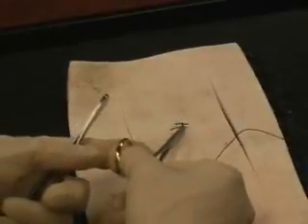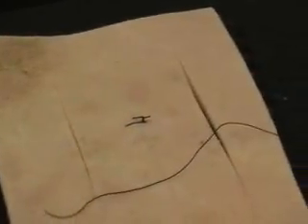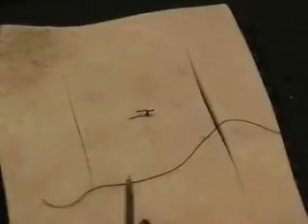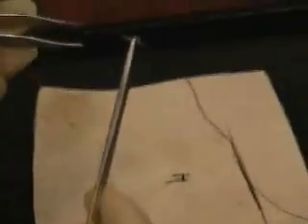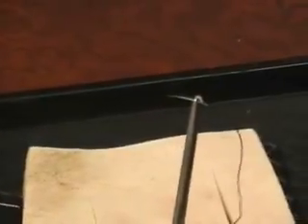The thing about this simple interrupted, there was tension equally on both sides. With a horizontal mattress, we're going to actually pull one side over toward another, and you'll see what I mean by that in a moment. We're going to load up exactly the same way. Here's our smiley face pointed to the left side. We're going to come down like we're shaking hands. Memorize that position, double check, make sure all those things are in place, what we talked about before.